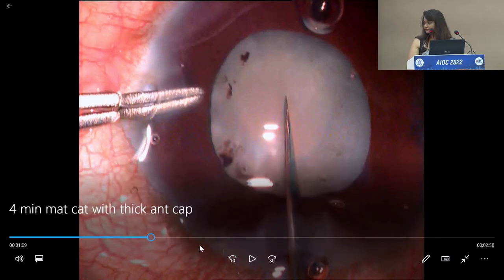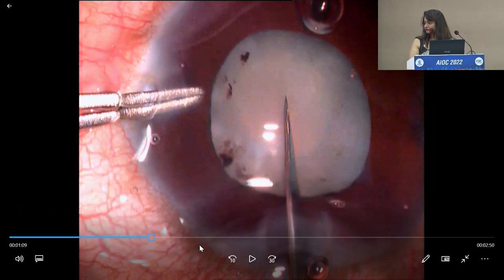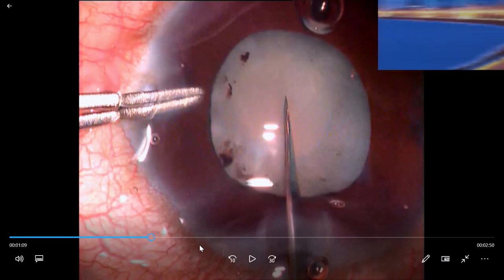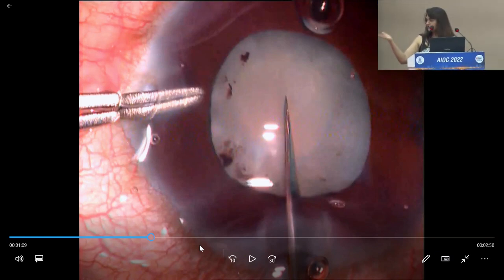But that is never in the center. A calcified subcapsular plaque is more like a fibrosis. I think that was a true exfoliation, if you ask me. True capsular exfoliation that was taken out in the first go. Yeah, it was too thin to call it a complete capsule. So I would agree with Dr. Rohit.